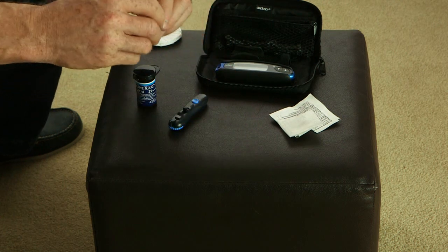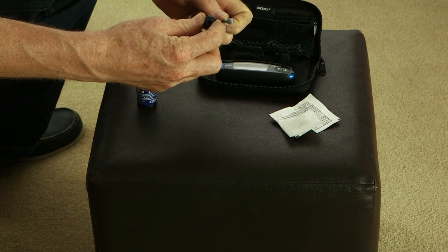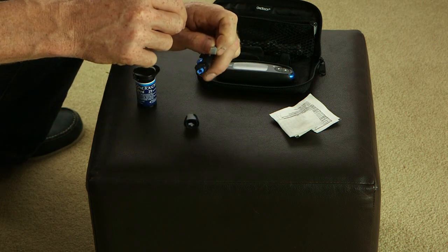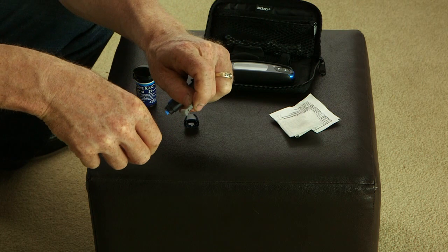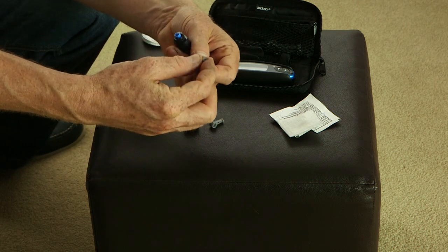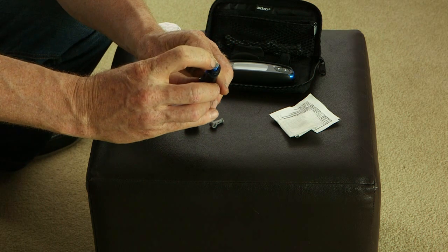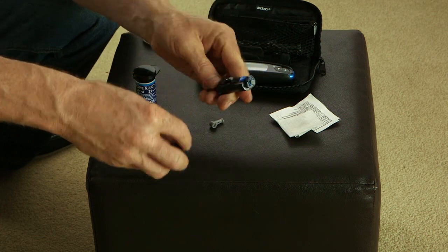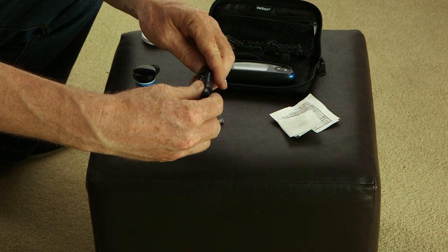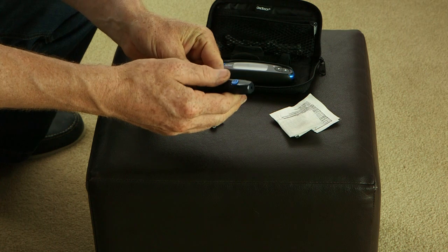So the lancets, these are nice. They make it really easy, especially with these activators. So you'll open this up. I did not have one in there before. So you'll take out the old lancet, take out the piece on it that blocks the needle, and put that right in the spring-loaded device, like so. And you'll then put the cover back on, like there, and make sure it's loaded.